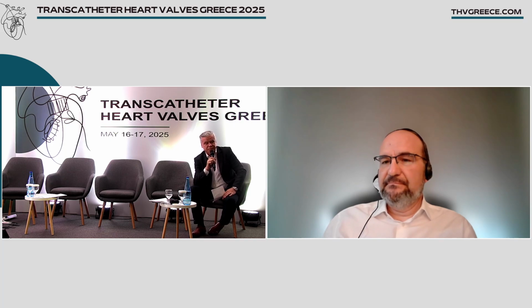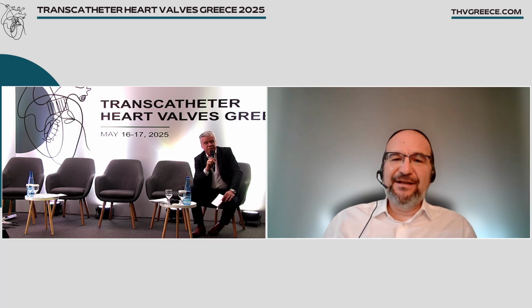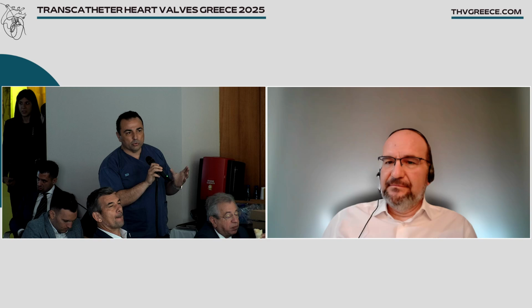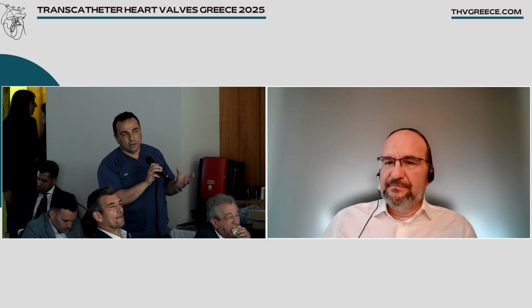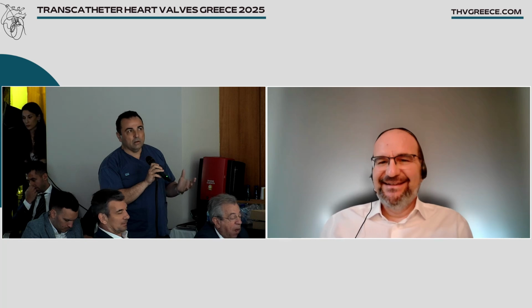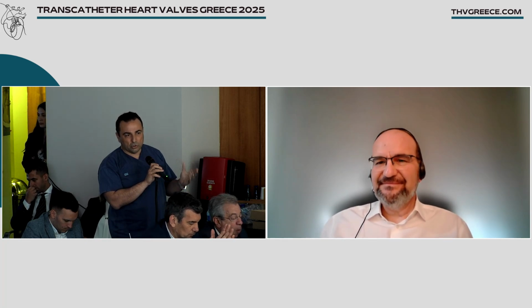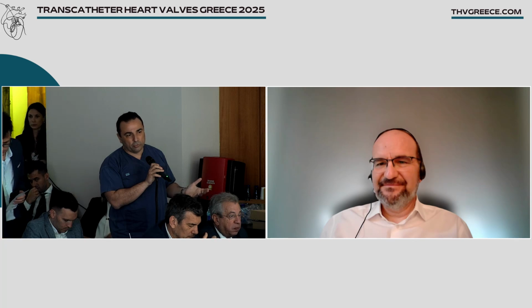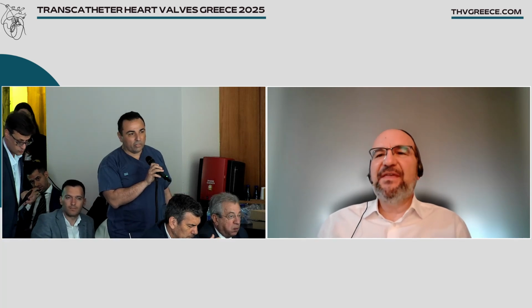Mr. Dardas, this is Michael Toutouzas. How are you doing? Yes, Michael. I would like to ask you, you did a great job and you protected the left main, but why did you expand the stent before checking if the left main was obstructed or not? Because if there is a danger, you put the stent in order to be safe, but if there is no obstruction, you don't have to deploy it. Okay, thank you very much.